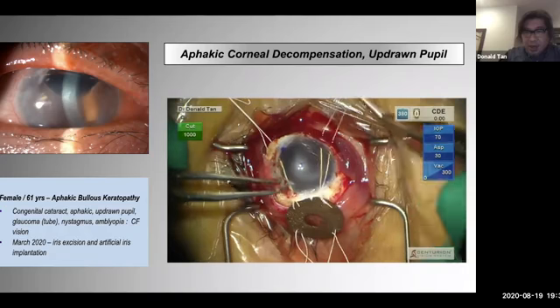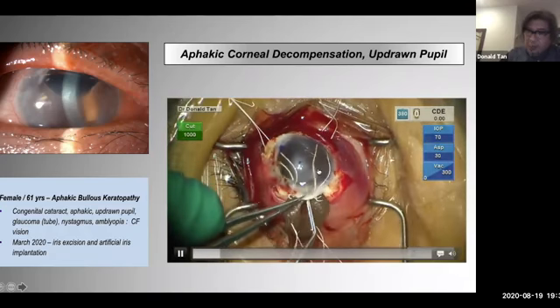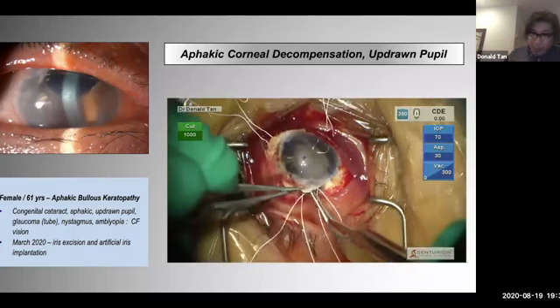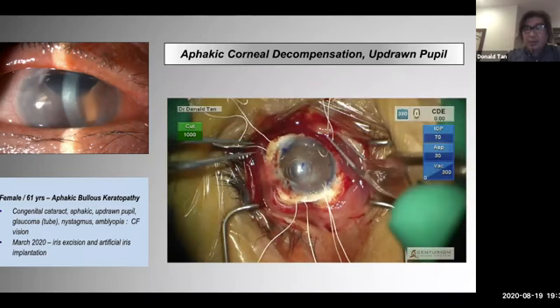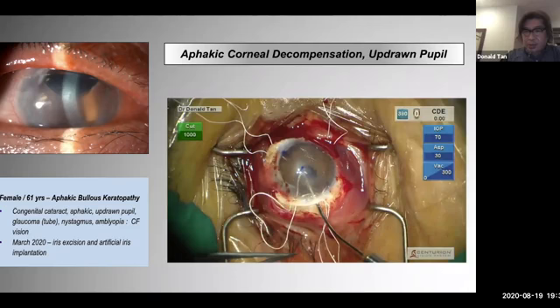And I've excised the iris here already. And in this case, you will notice that I've pre-placed the sutures because this is an aphakic eye. Okay, so we don't want this dropping in. Her other eye is aphakic, so we didn't want to put in an IOL. And you can see that having the pre-placed sutures already pulled through really allows you to control that tissue.